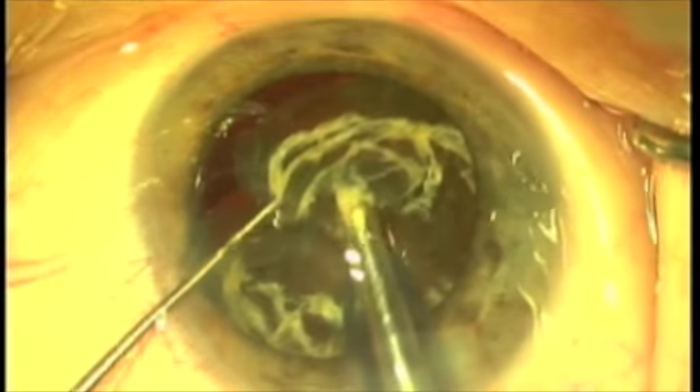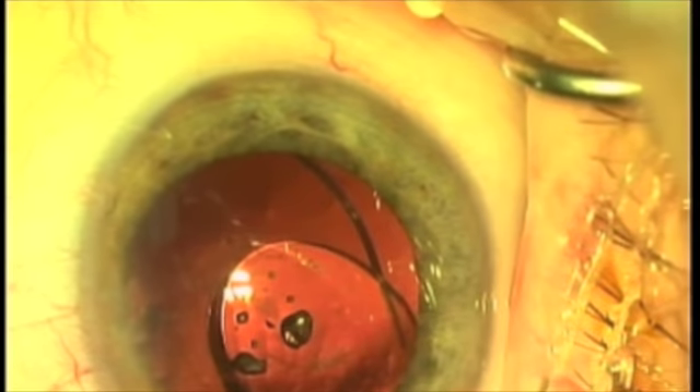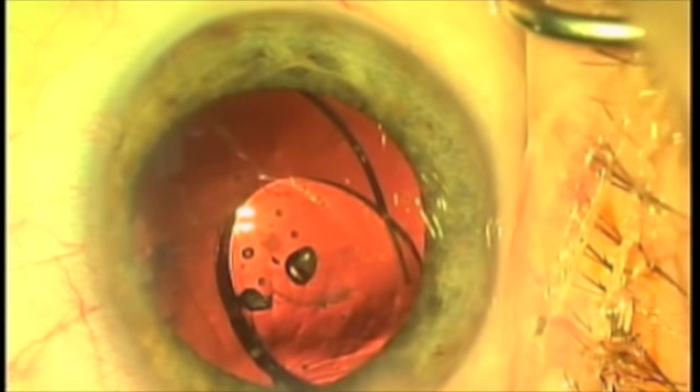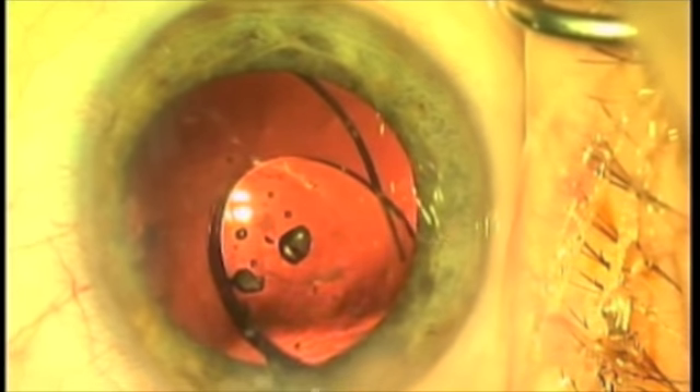It's not in the lens bag, so you're not going to break the lens bag. The lens bag, if you remember, was pushed way back. We've removed the nucleus and now we've inserted the IOL.